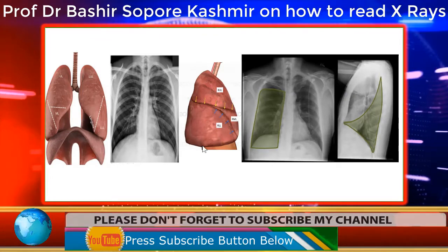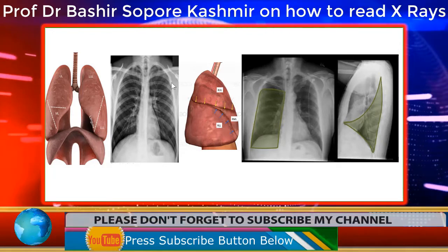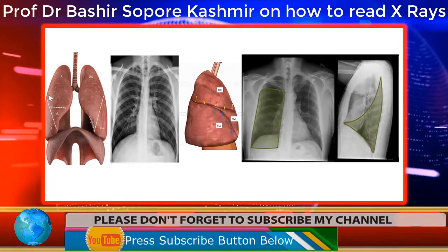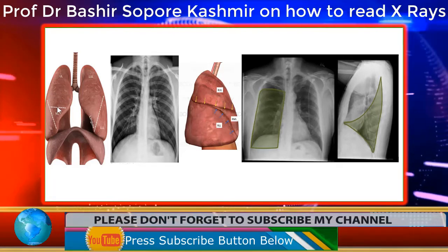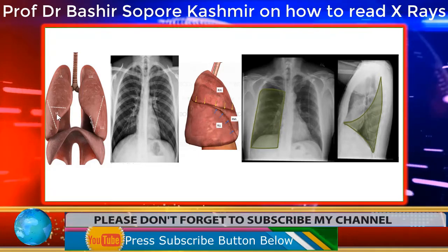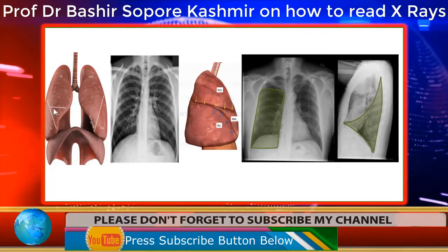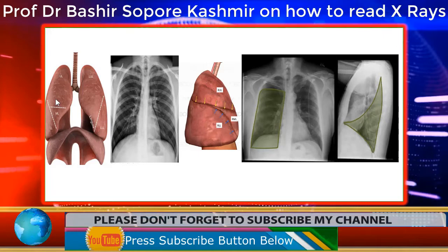Now here comes again the part played by the superimposition. Now suppose the lower lobe is involved. Suppose the horizontal fissure was here in this image. Then this whole area will get radio opaque. Now suppose the middle lobe is not involved, but still we can see that there is a radio opacity from this line downwards. If we take this horizontal line a little above, this is because of superimposition, as I said.